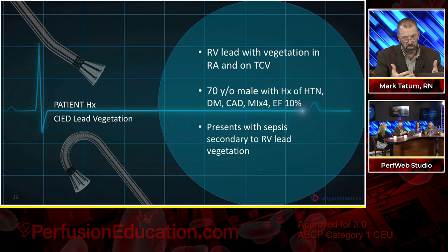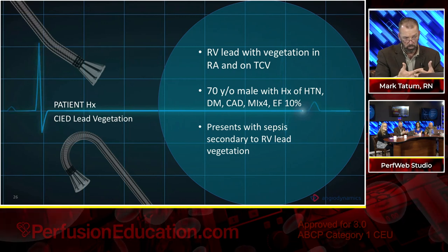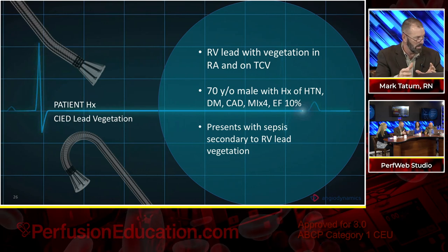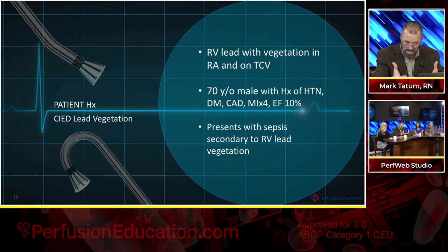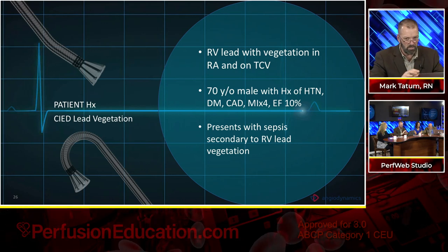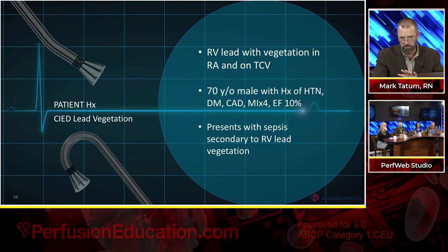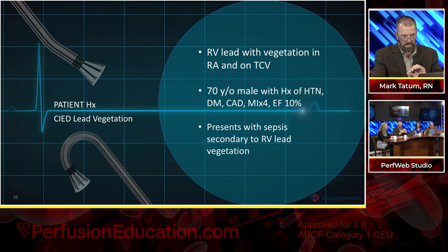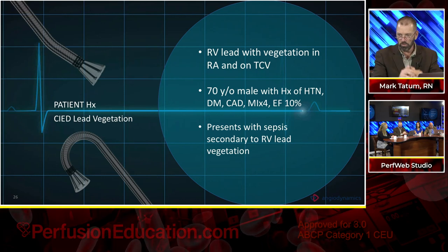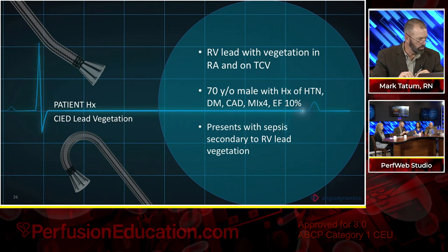So when we see patients like this, our team is mindful that we want to talk about induction with medications that don't block sympathetic tone, to help maintain the constriction you have in the periphery, maintain the pressures that you're achieving, and make that happen. But from a hemodynamic standpoint, when you talk about an AngioVac case in general, because we are veno-venous, from the pulmonic valve all the way through, we're pulling and returning at the same rate, so we just don't see a change in hemodynamics. Yeah, it's a closed circuit. Closed circuit, closed system, yes.